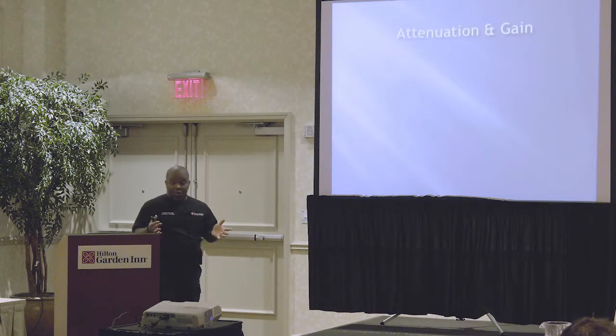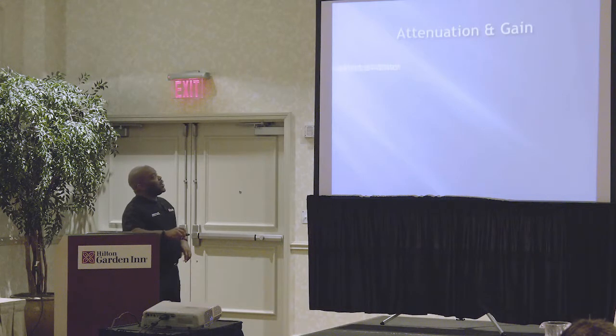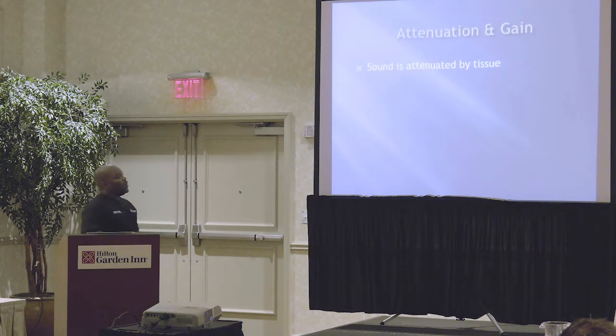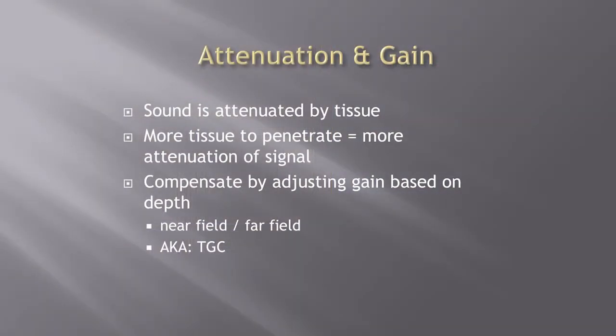Sometimes there's stuff you can do about it, sometimes there isn't, all right? But you wanna fix the gain so you can get a better image. So as you're losing the sound wave to the tissue, you allow the ultrasound to stay in a listening mode longer, so it waits longer for the sound to come back home, because it's going so far into deep tissue. So again, the more tissue you have to penetrate, the more signal you're gonna lose. That makes sense, right?